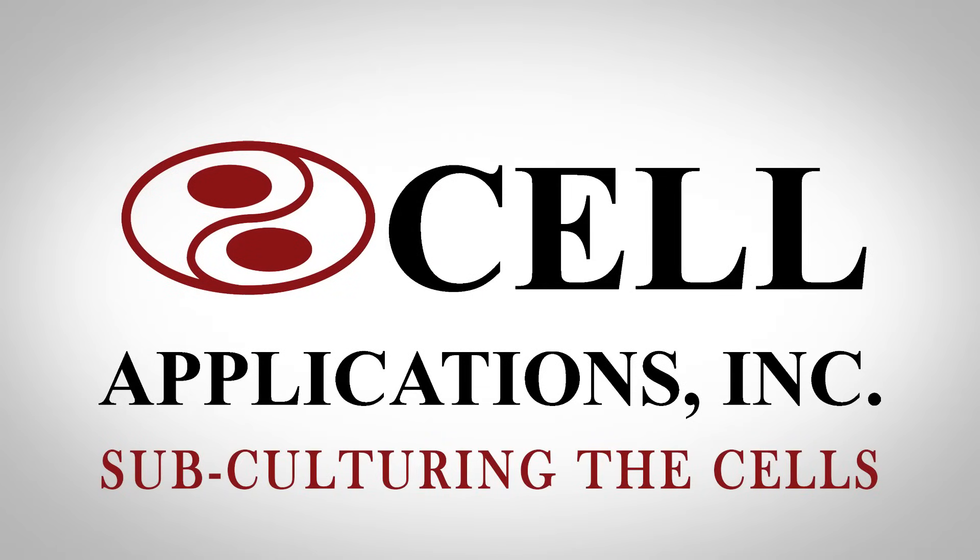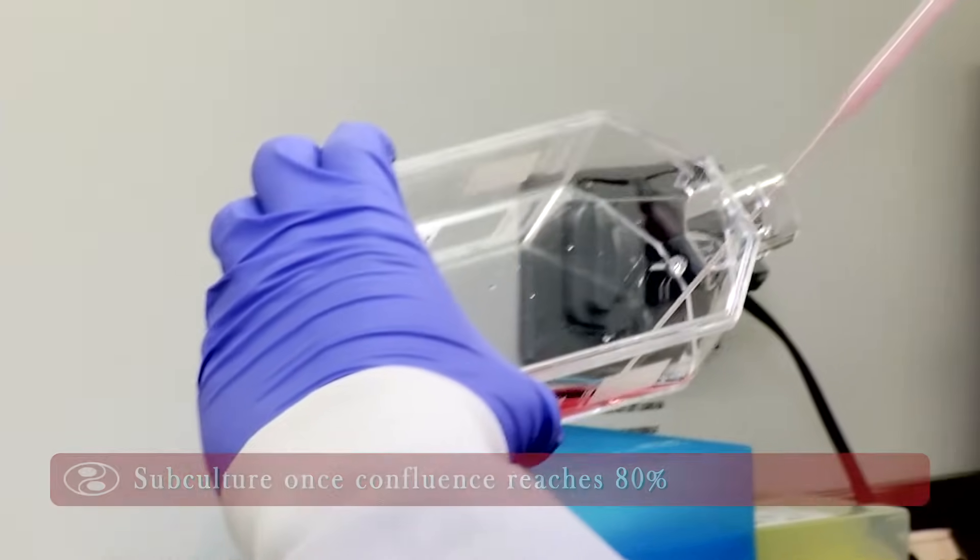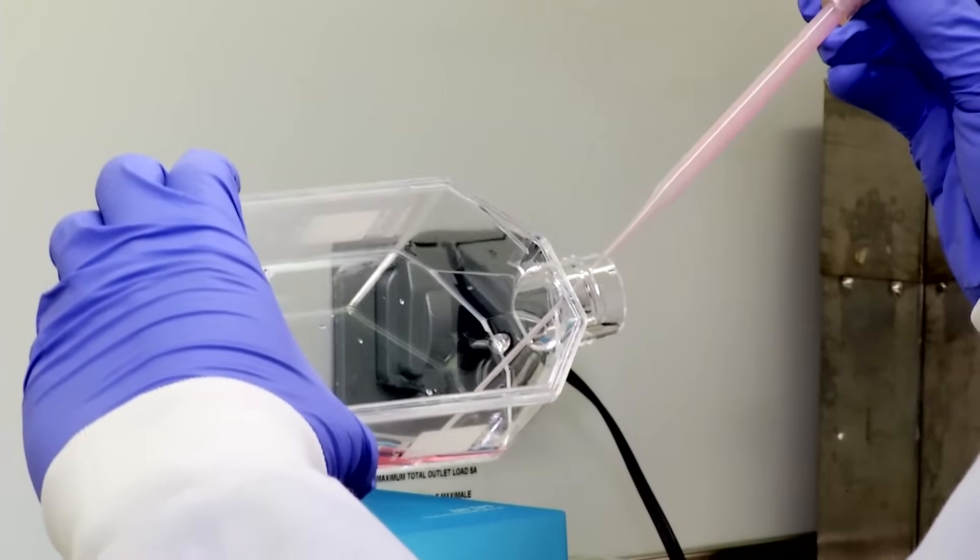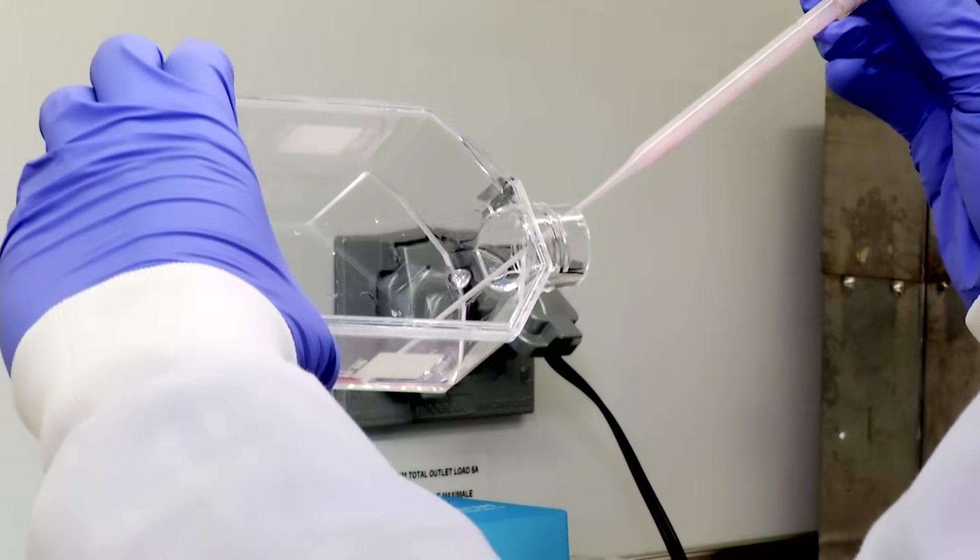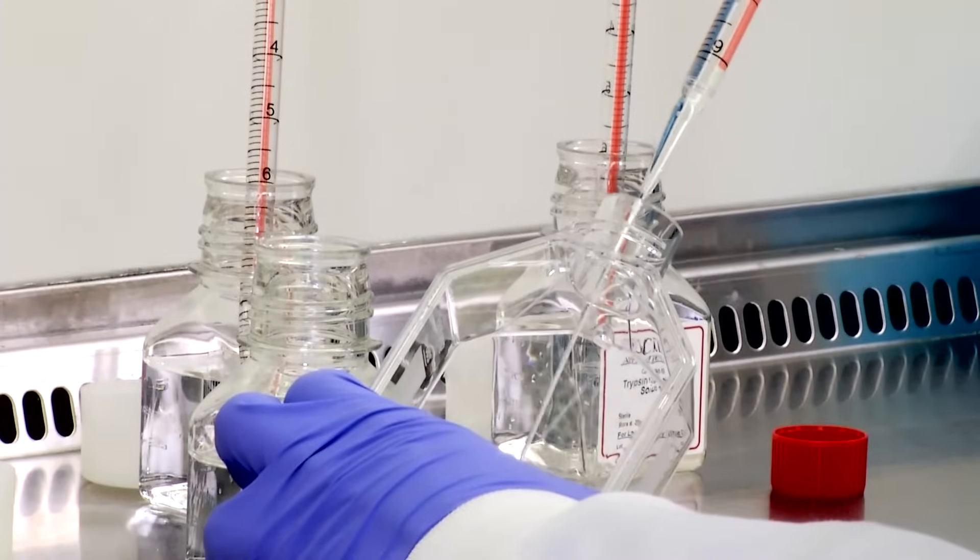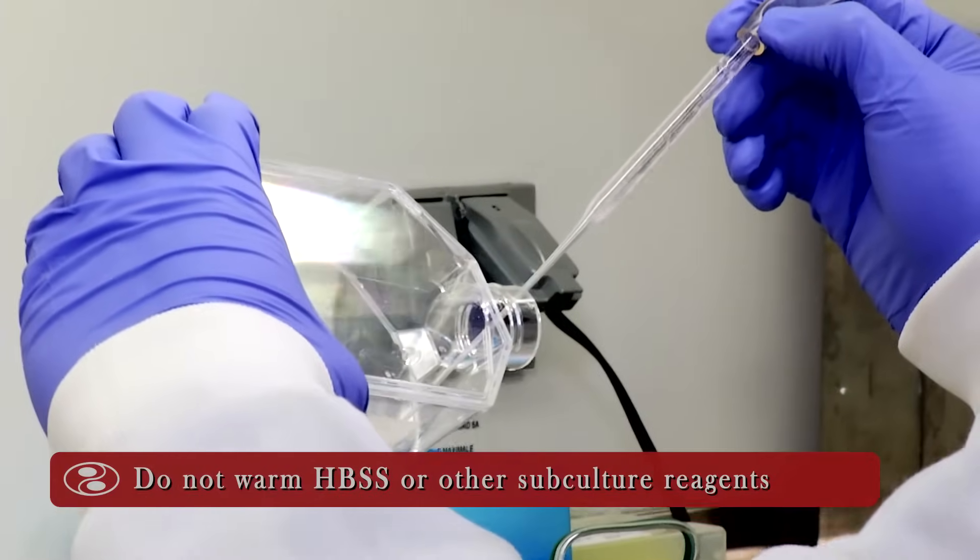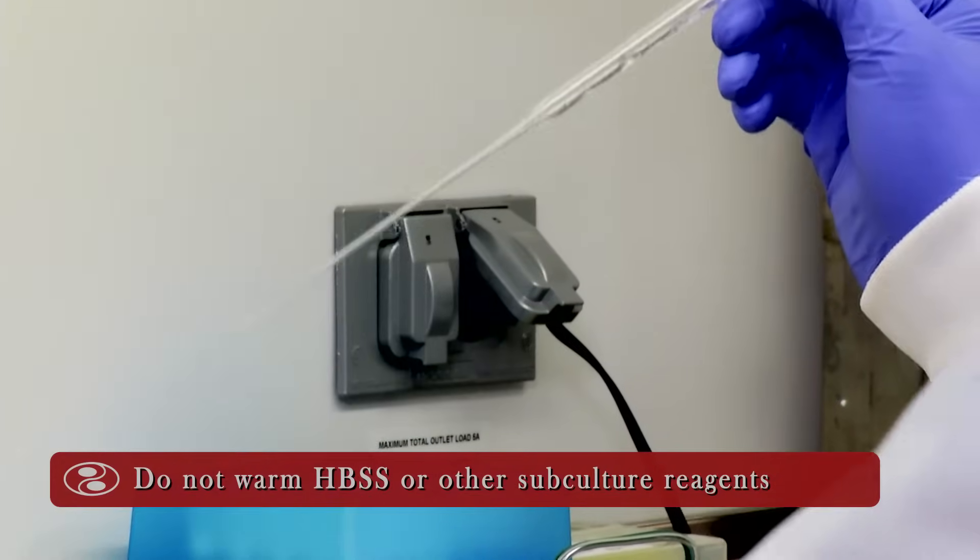Subculturing the cells. Subculture once confluence reaches 80%. Aspirate medium from flask. Wash attached cells with HBSS and remove HBSS. Do not warm HBSS or other subculture reagents.